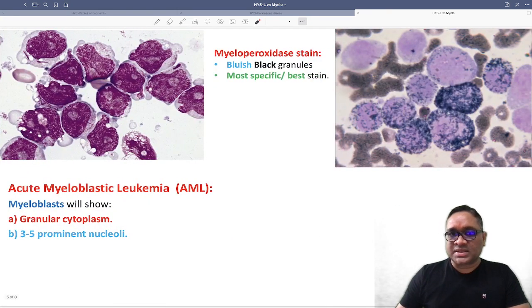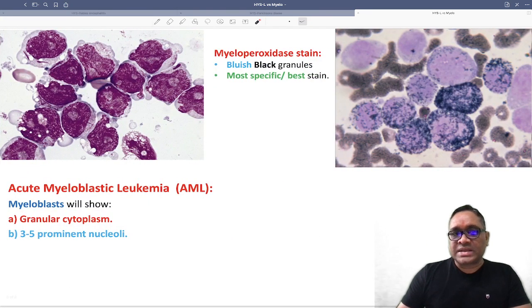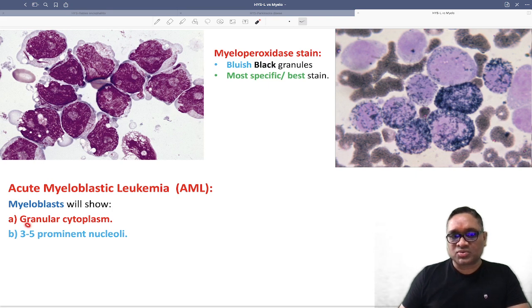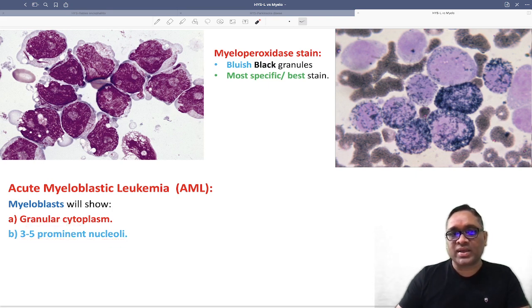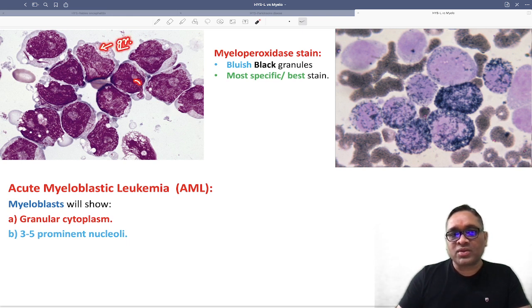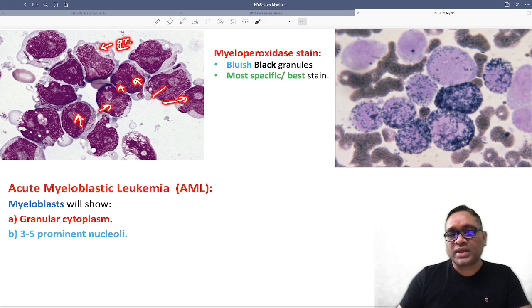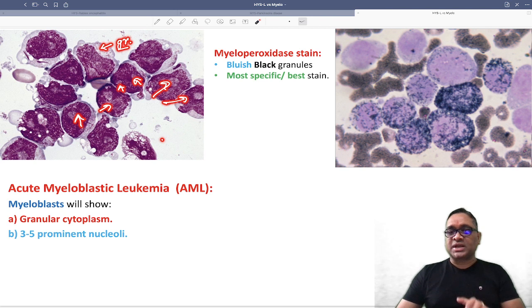When looking at myeloblastic cells, you can see myeloblast cells will be having granules in their cytoplasm — granular cytoplasm — and three to five prominent nucleoli. In this cytoplasm there is a granule, and you can notice all these are prominent nucleoli.